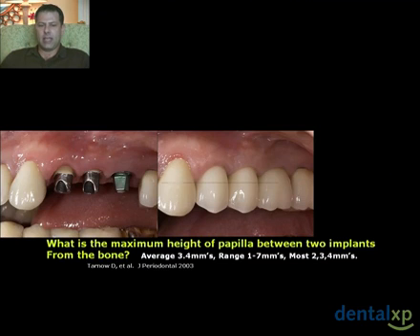and an implant. And if you draw a line and you see the relationship of the canine to the bicuspid, which is a tooth to implant relationship, you can see how much more coronal that papilla is as compared to the papilla between the implants themselves. So in terms of what we were able to achieve in tissue height, this is about as good as you're going to get.